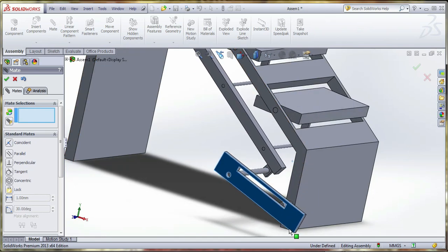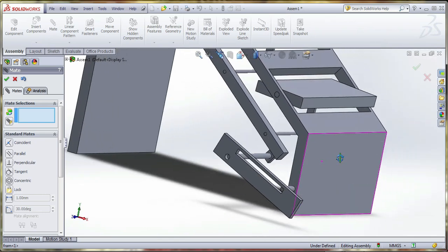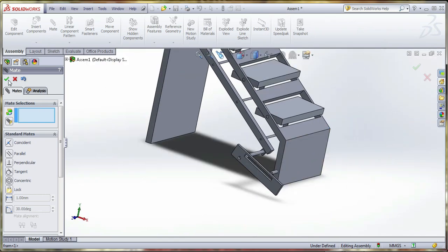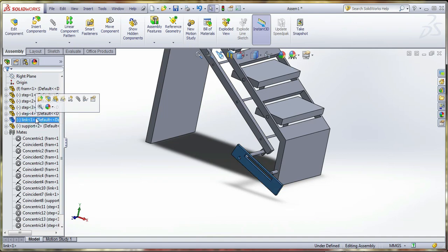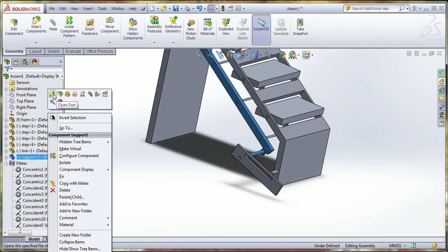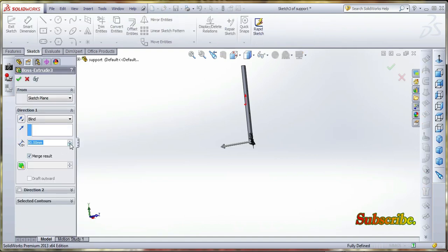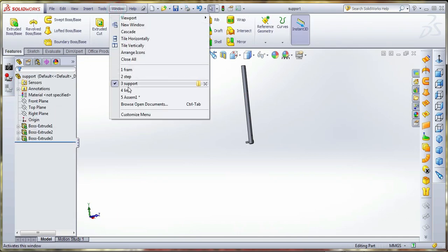Okay, made the same for all the surfaces. Now we're going to fix this pin. The reason is the support pin is somewhat bigger in length. You can reduce the support pin length. Open and reduce the length up to 20. Okay.